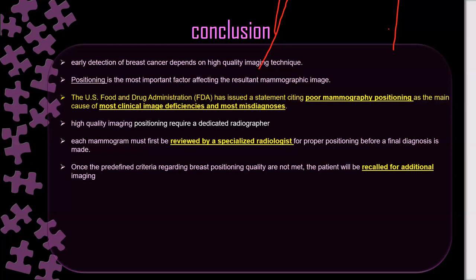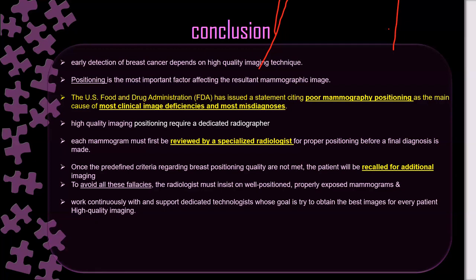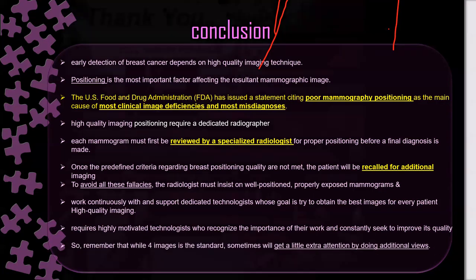Reviewing the imaging and improving the quality will definitely reduce the recall. And to avoid these false results, radiologists must insist on well-positioned, properly exposed mammograms, and work continuously with and support dedicated technologists, who must be highly motivated and recognize the importance of their work to consistently improve the quality.